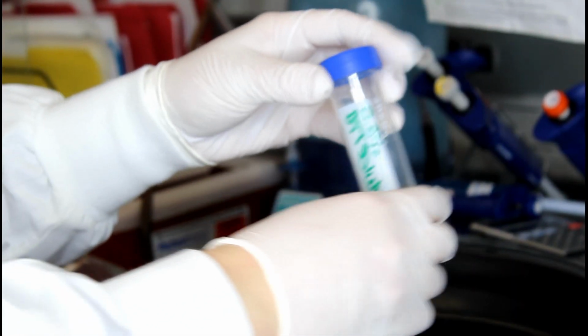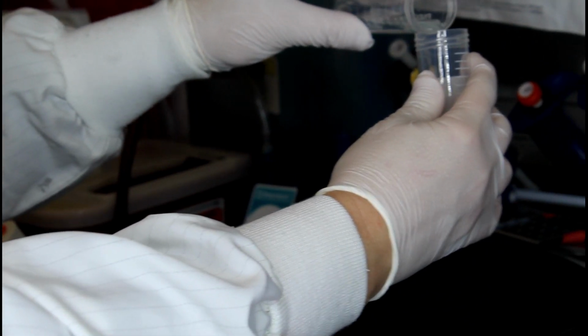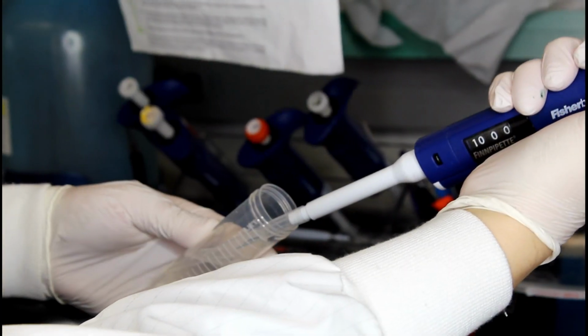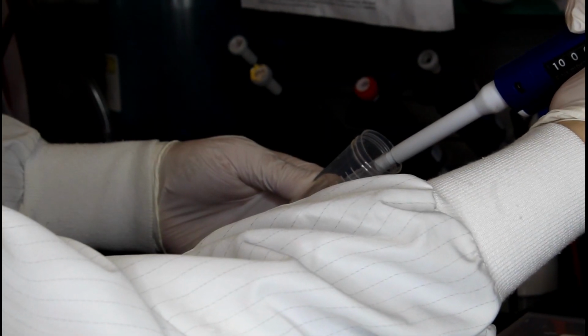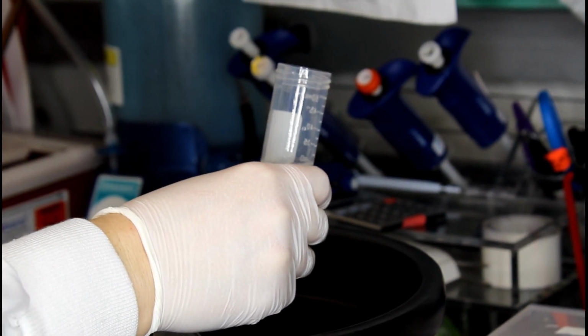To the master sample, you will add a volume of 0.2% dithiothreitol, otherwise known as DTT, that is equal to the same volume you previously removed from the master sample. Following the addition of the DTT, you will pipette aspirate the sample up and down several times to ensure adequate mixing. Following that, you will put the sample on a rotating tumbler for 15 minutes.